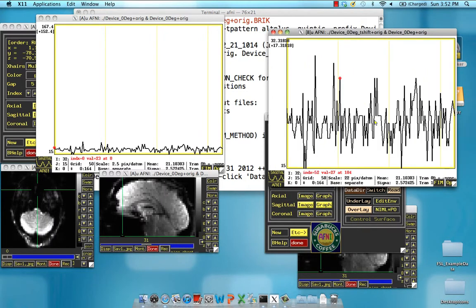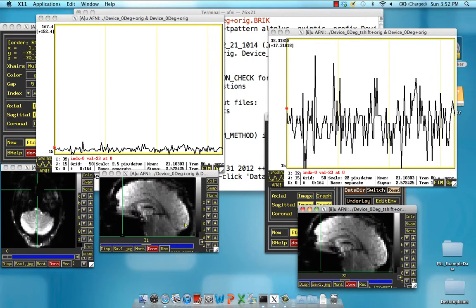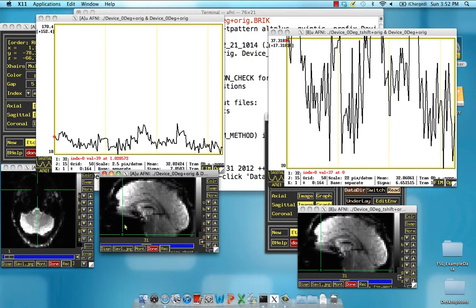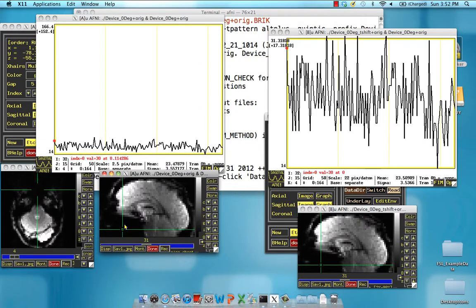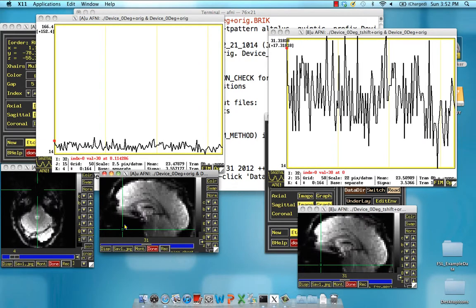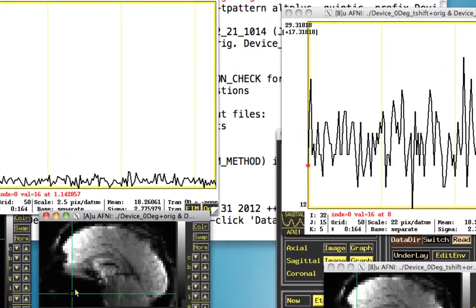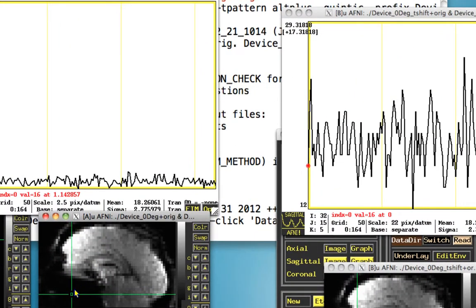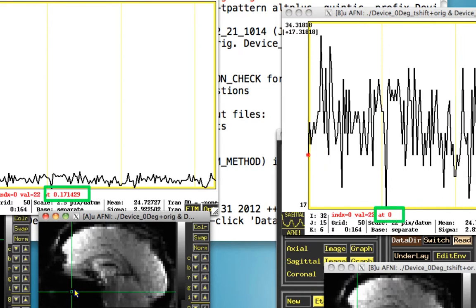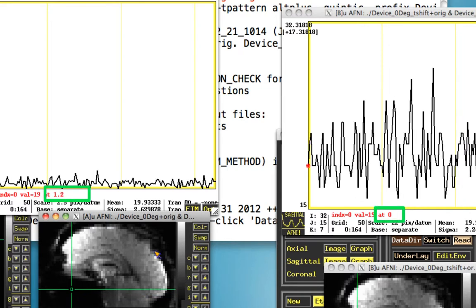By the way, I'm typing MM to reduce the matrix size and then A for autoscale. It's kind of a tick at this point. But again, so we're at time point zero and we're at slice zero. Okay. Now, recall for the raw data set, when I go up each slice, it is going to be going up by fractions of a TR since each slice is acquired at a slightly different time. But notice at the same time over here, as I'm increasing in slices, the time point remains zero. This is because it has been slice time corrected.